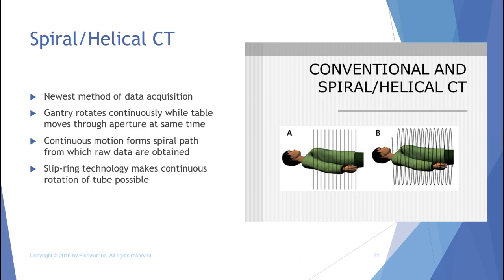Okay, helical CT. We had mentioned in class that there are two types of CT scans that you can do with your scanner. You can do axial scanning and you can do helical scanning. Axial scanning is more detailed, so you use those for detail, like in head imaging or specific vertebral body spine imaging.